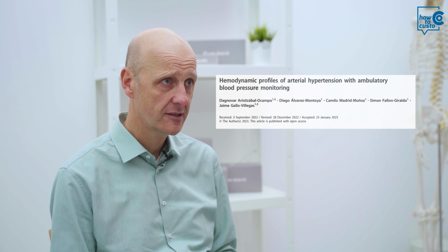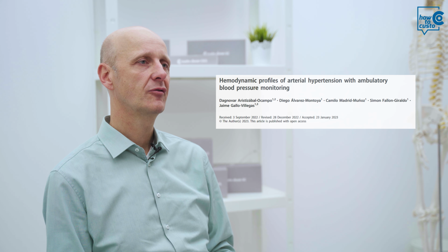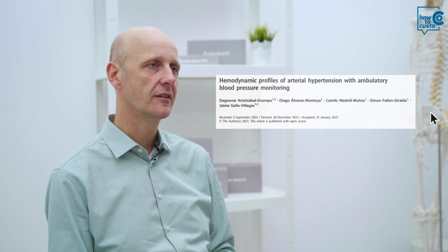In this publication, the concept of hemodynamic phenotypes was used in a clinical study involving over 7,000 patients, who were then treated according to their hemodynamic phenotypes, and follow-up examinations were carried out to see how the blood pressure situation had changed in these patients, whether it had improved when the hemodynamic phenotypes were used as input parameters.